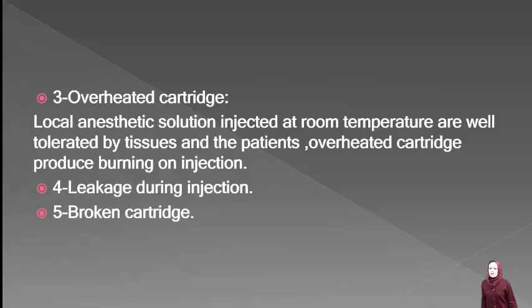3. Overheated cartridge. Local anesthetic solution injected at room temperature is well tolerated by tissues and patients. Overheated cartridges produce burning on injection. 4. Leakage during injection. 5. Broken cartridge.